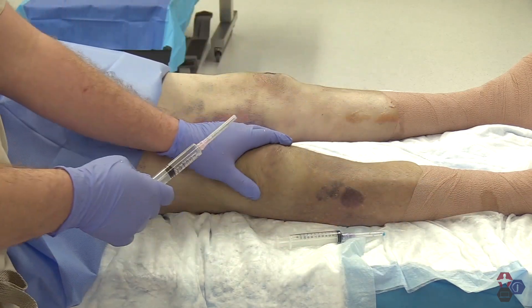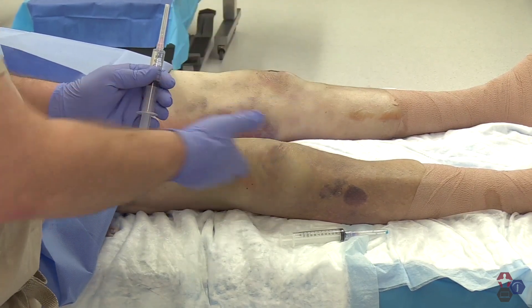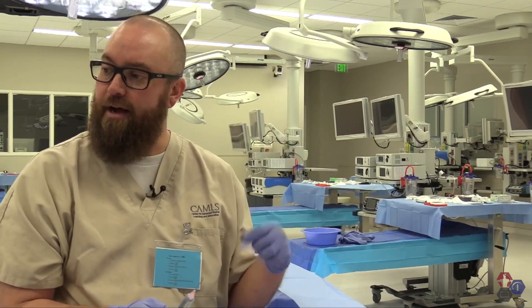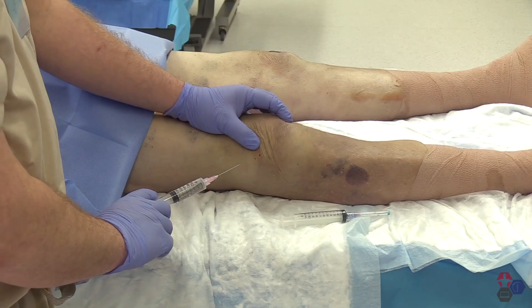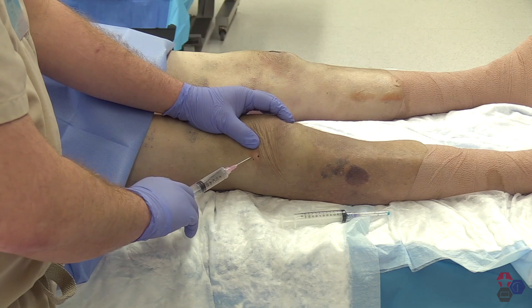The first step is to anesthetize the skin overlying the puncture area. Cleanse with chlorhexidine, apply a sterile drape, and then administer local anesthetic. The key to anesthetizing is that you only want skin and shallow tissue anesthesia. You don't want deep anesthesia for fear of violating the joint capsule and altering the results of the synovial fluid you're attempting to gather for analysis. Inject a small wheal and then go slightly deeper along the path.